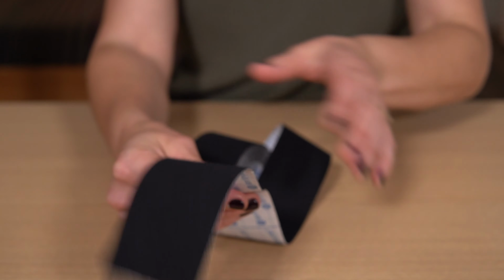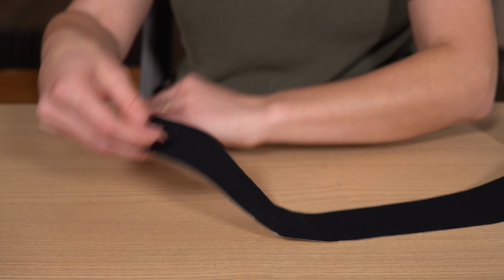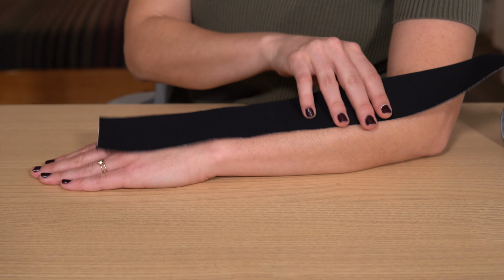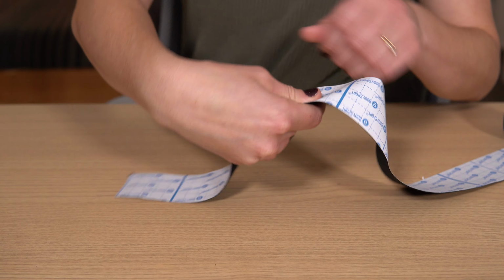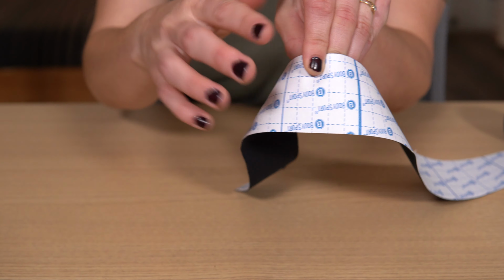I was just showing you there, that's the grid pattern that is on the back of all Kinesio tape brands. And it just helps you get a good estimate of where you're going to be measuring out and cutting for the length of your K-tape. So I'm showing you how to get a good estimate for the amount of K-tape you'll need for this application. And that's the line that I'm going to cut on.